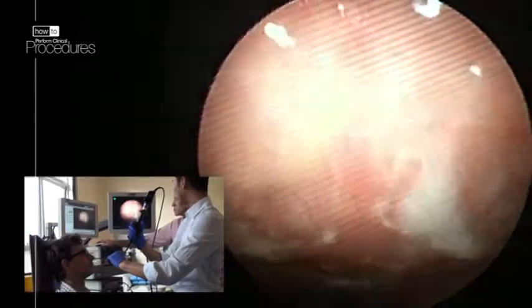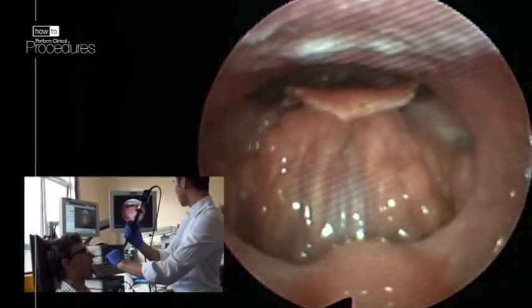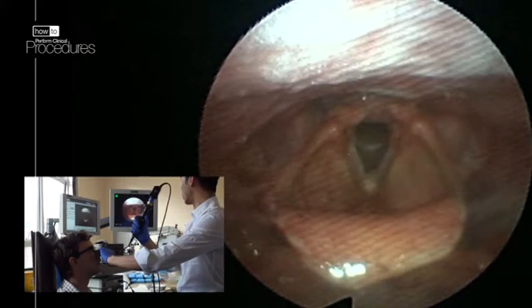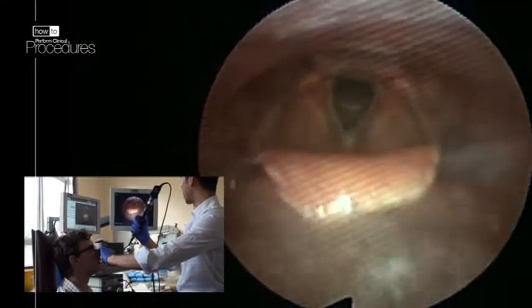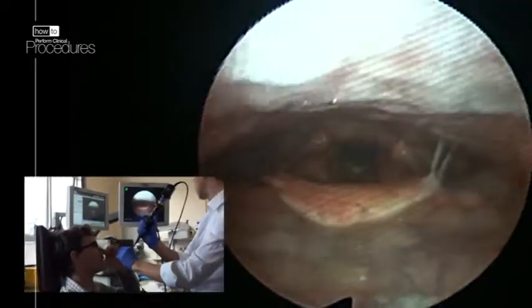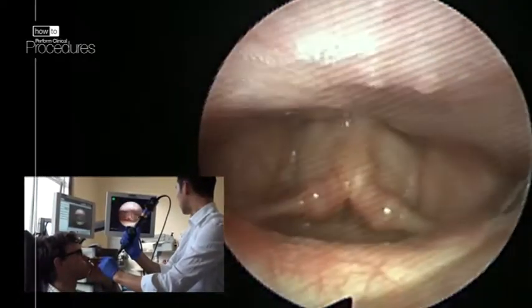We are now turning 90 degrees downward. Ask the patient to stick their tongue out. The tongue base and lymphoid tissue can be seen. Here the epiglottis and vocal cords are clearly visualized. Ask the patient to say 'heee' to visualize vocal cord adduction. If you ask the patient to puff out their cheeks, you may also be able to visualize the post-cricoid areas.